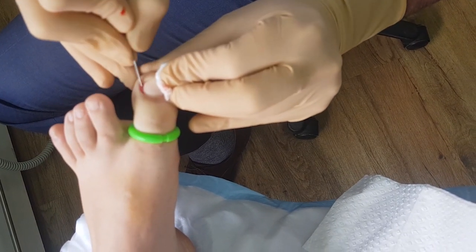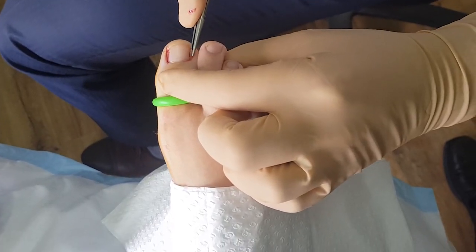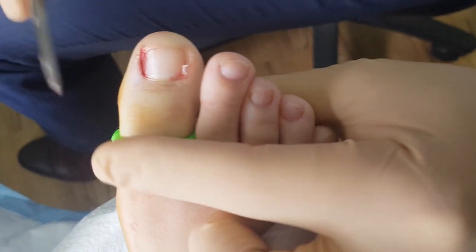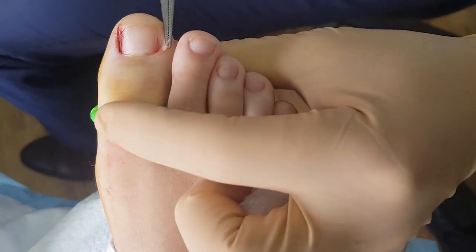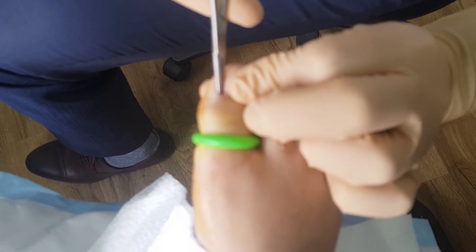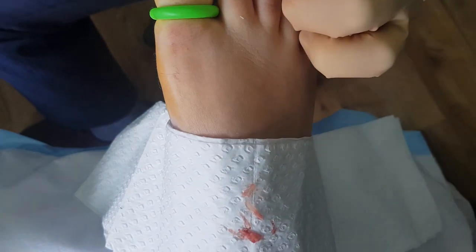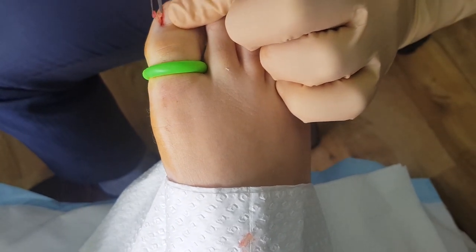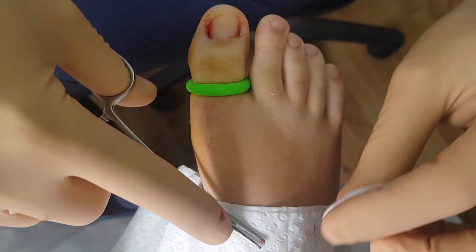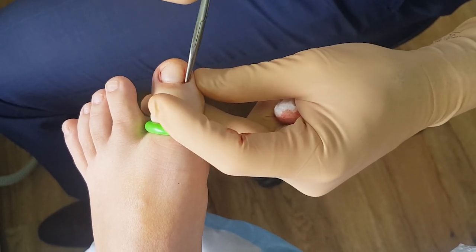This nail has been obviously cut prior — put some angulation on it, there we are. Put the hemostats right down, and just as normal pull it out, and then you can see some of that soft tissue there that will need to go. If you didn't have a tourniquet, what do you sometimes use? Use the glove — the little finger glove technique. Wrap it up on the top of the hallux and bring it down.